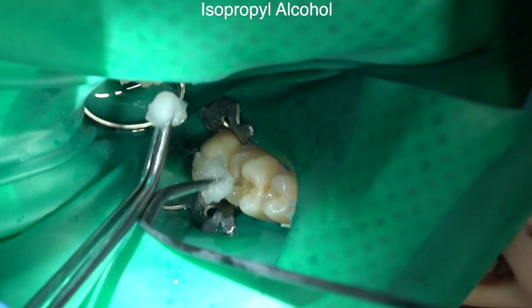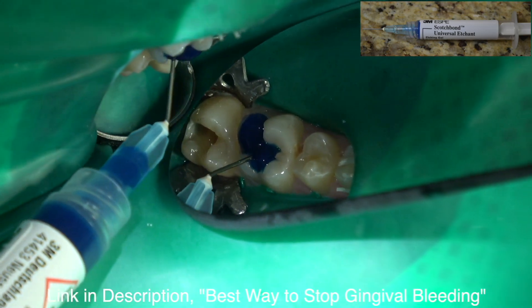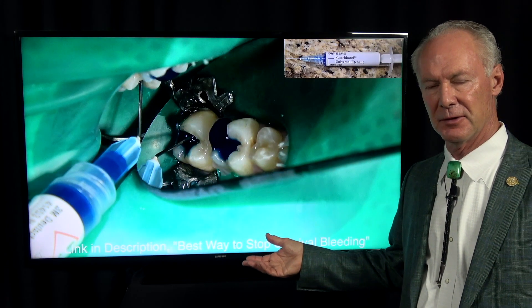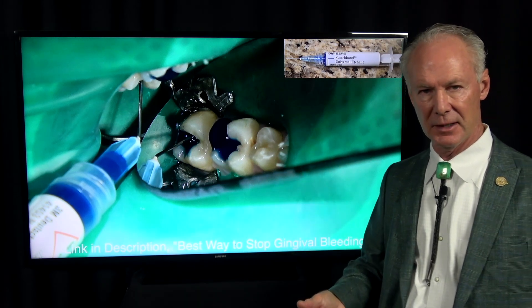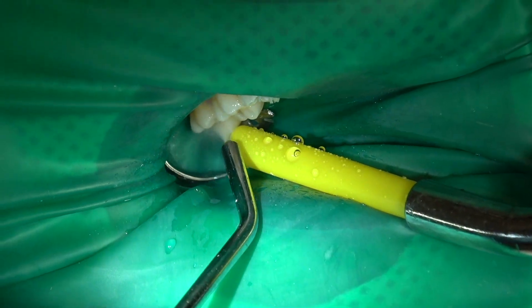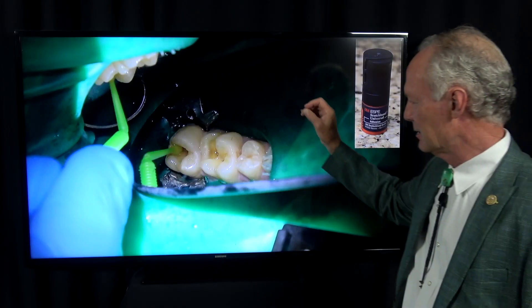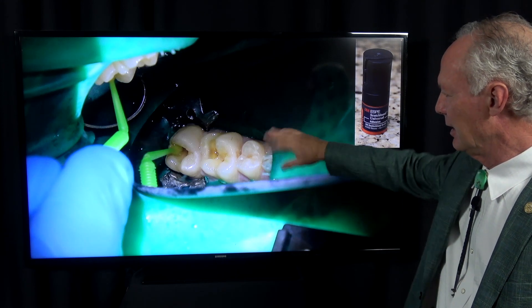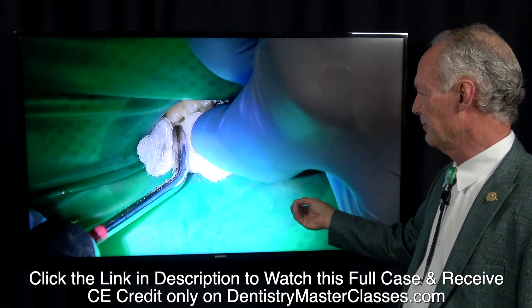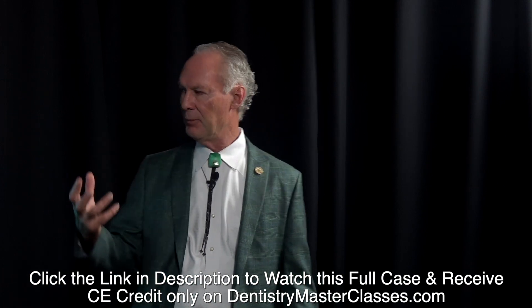There's the isopropyl alcohol. Once I've removed everything and have good firm tooth structure on the floor of the prep, this is 38% phosphoric acid. Remember, you can etch enamel basically as much as you want — I'll usually etch enamel for 45 seconds to a minute. Dentin you only want to etch for about 15 seconds or you can collapse the dentinal tubules and you'll lose the hybrid layer when you place the primer adhesive. Then rinse and dry — it doesn't have to be desiccated because acetone is hydrophilic and attracted to water. If it's a little damp, that's okay. Then blow the primer adhesive dry — the acetone will pull the primer down into the dentinal tubules, but you want to blow it dry to get rid of the acetone because it can negatively affect the bond strength.